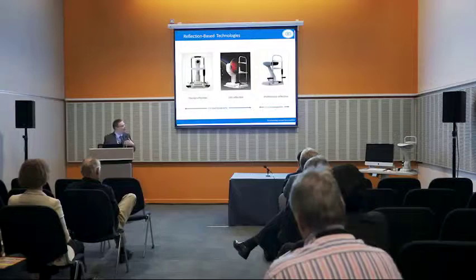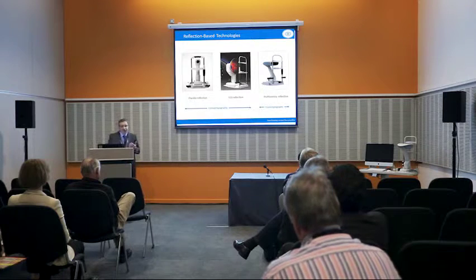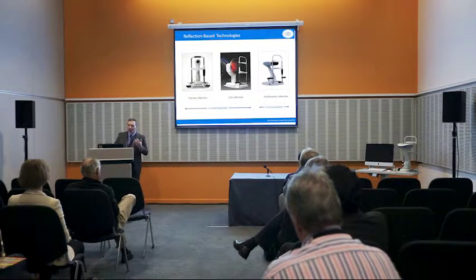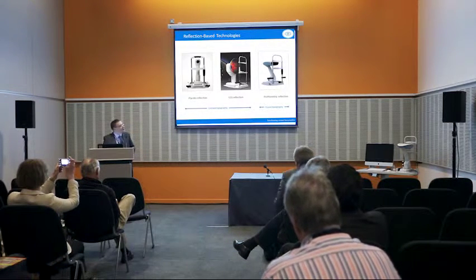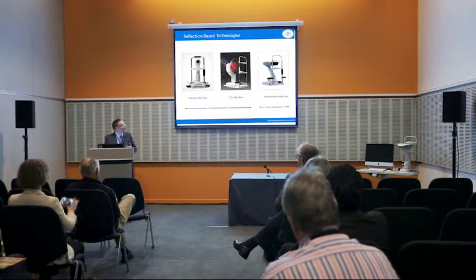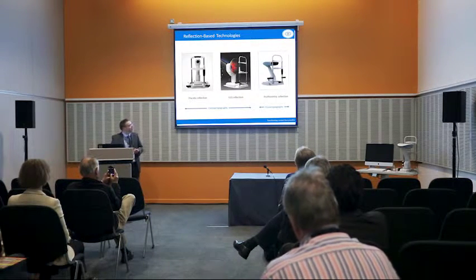They're reflection-based systems that rely on specular reflection of the tear film. So they are limited to just the corneal topography. Now, as I said earlier, when we're thinking about contact lens fitting and more advanced contact lens fitting, we actually want to be thinking outside of the cornea. When we look at profilometry with the ESP, we're actually talking about ocular topography. So we're talking about being able to measure the whole of the cornea to the limbus, and as Brian said, up to 20 millimeters outside and into the sclera.